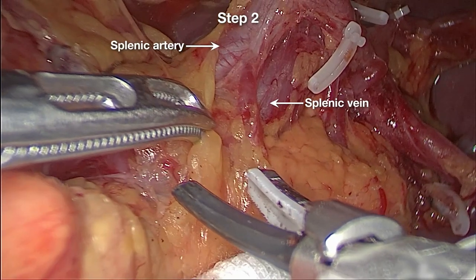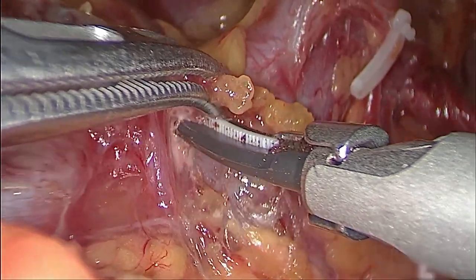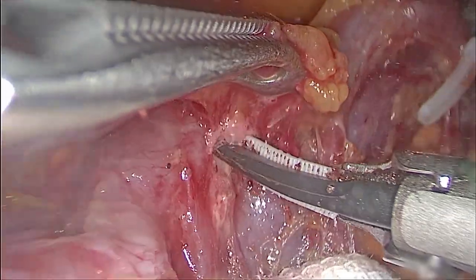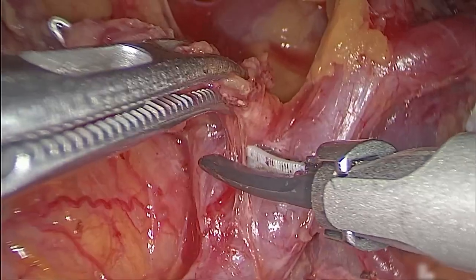Step 2. We dissected the lymphatic fatty tissue along the splenic artery trunk. We skeletonized the middle of the splenic artery trunk until the crotch of the splenic lobar arteries.